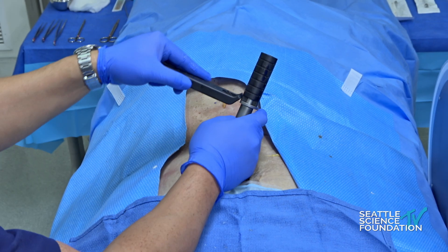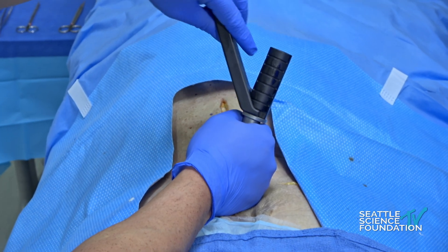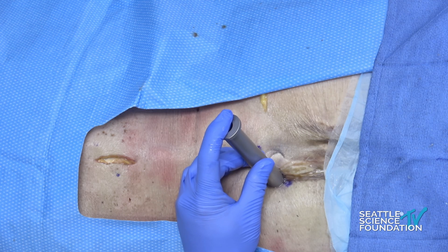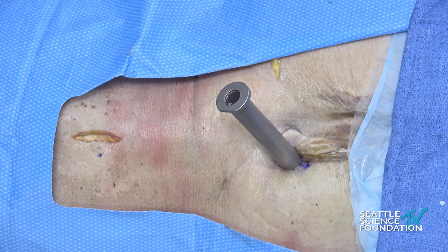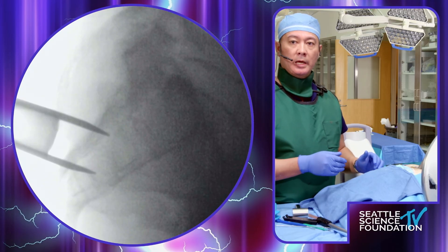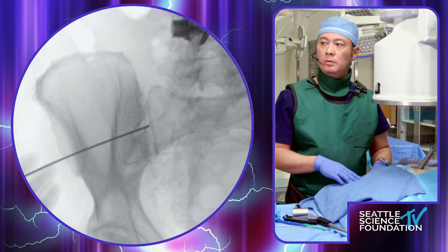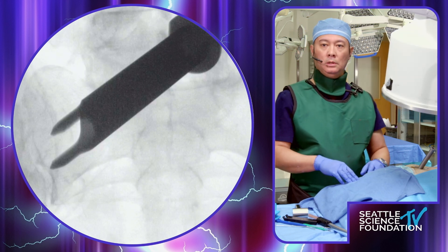At that point you're going to find that the dilator may be fixated in there, and we use the helper bar to kind of pry it up — and now it's loose and free to be removed. We now switch to the decorticator, which is also keyed. We're going to those tines we were talking about earlier, making sure we can see them in the cranial tilt and caudal tilt — the inlet and outlet views — so we're making sure we're staying within the joint itself.